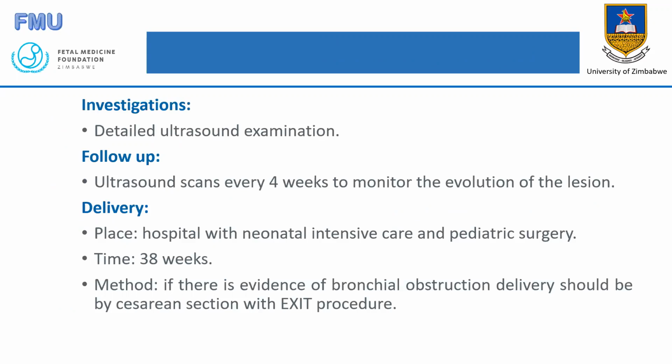Detailed ultrasound scan examination is highly recommended to look for associations. Always remember the presence of one defect will mean that you have to look for the other defects. This is the reason why, if you are not able to assess all the organs of the baby properly, like it must be done, even if you pick a defect that you are very familiar with, you still have to refer to fetal medicine so that fetal medicine can verify and make sure that there are no other associated defects which you may not be able to satisfactorily rule out.